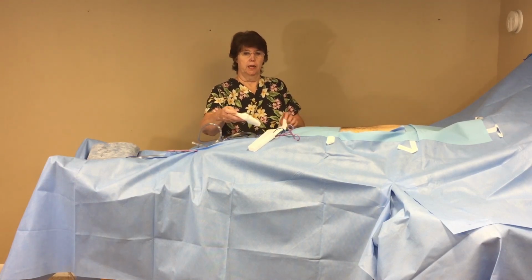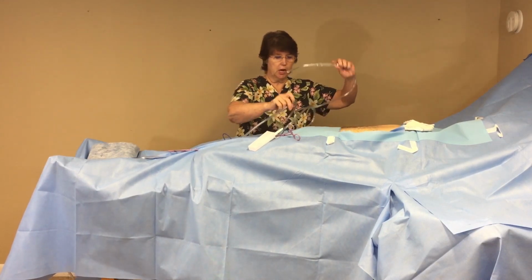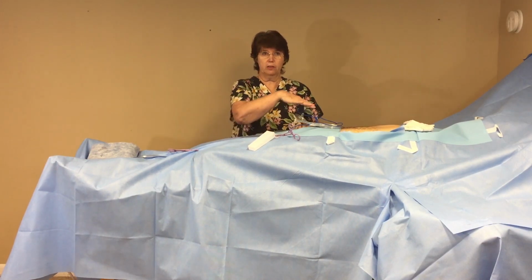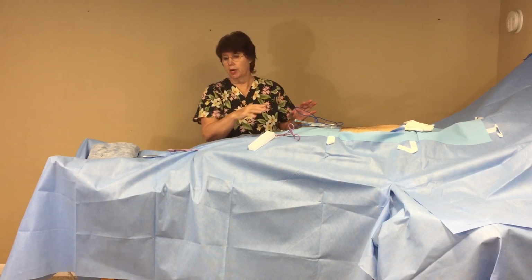So you want to get the lap drape, you want to get the suction up toward the upper part of your field, you want to make sure the bovie's up and you have enough length on this that it's going to be enough to use for the rest of the procedure.